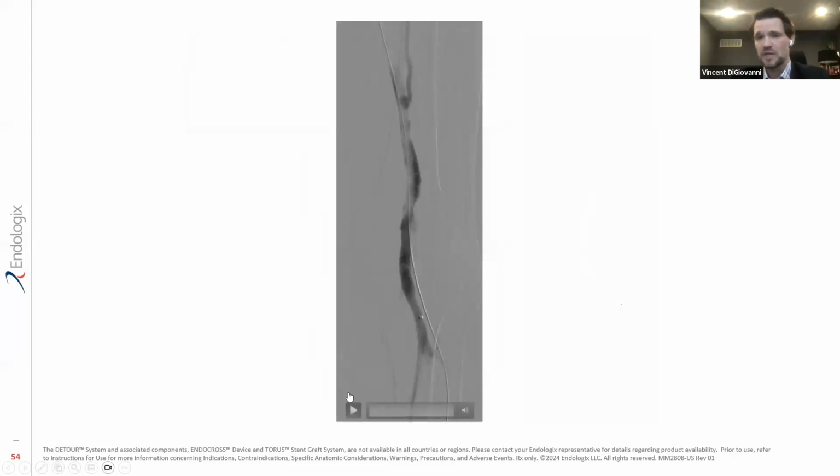Make sure you complete with your venogram. Be absolutely certain that you haven't caused any type of problem that's going to bring you back either that night or the following day. We've had 19 people that we've looked at for this procedure, and 17 we've treated.